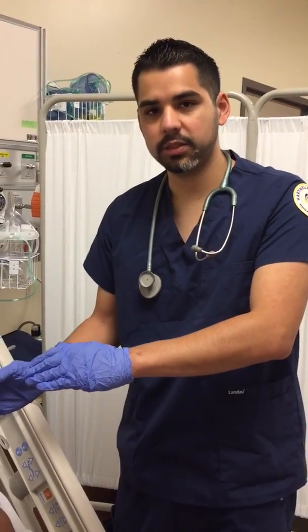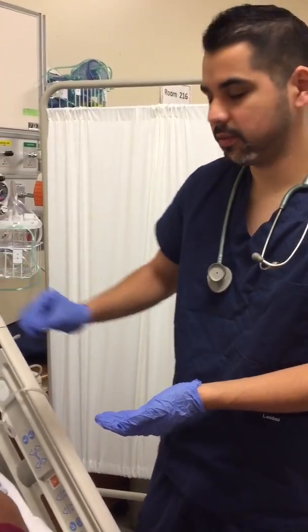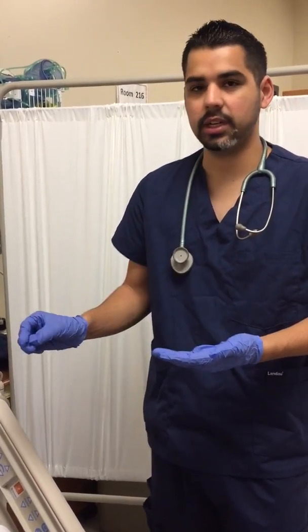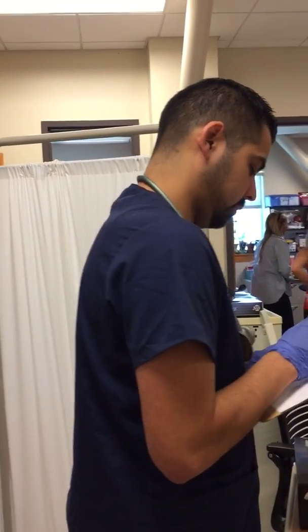You always want to make sure that the patient is sitting up normally and that the small volume nebulizer isn't tilted or anything. If it is tilted, that means the drug will be coming out. So while he's taking his medication, I would be charting to see if he's complying with the medication being given. So I'll be charting down notes. And it looks good. He doesn't look dyspneic. He is not using his accessory muscles, so he's tolerating the drug really well.